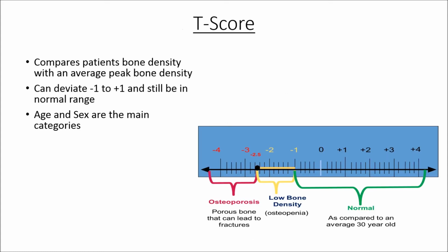There are two ways to compare bone density measurements, and this is one way, known as the T-score. It compares the patient with average scores of other healthy individuals without using their population standard. Having this score slightly under or over the average would still be considered a normal outcome. These exams can range from good bone density, normal bone density, osteopenia, osteoporosis, and severe osteoporosis.